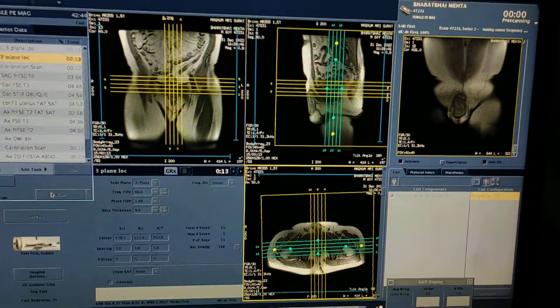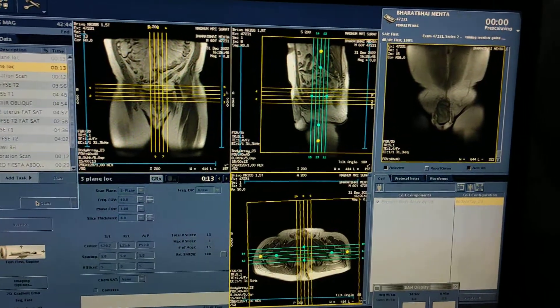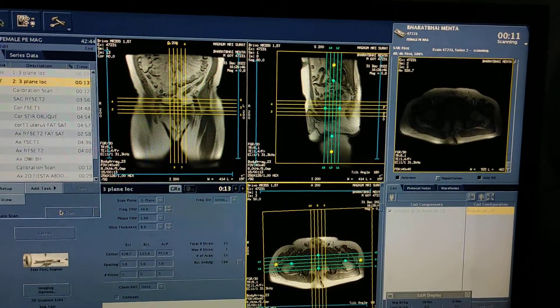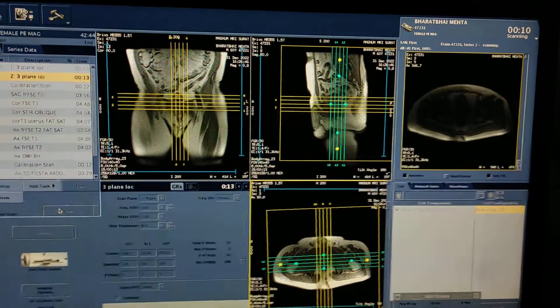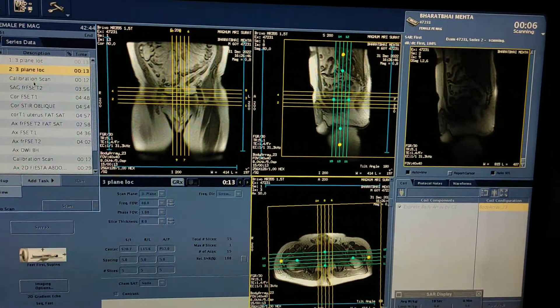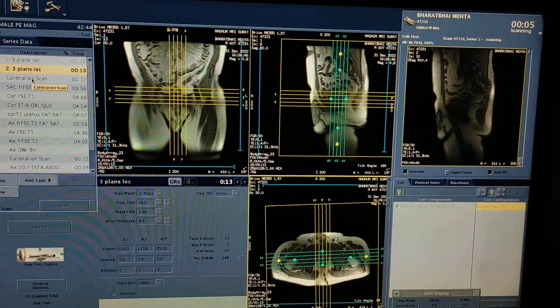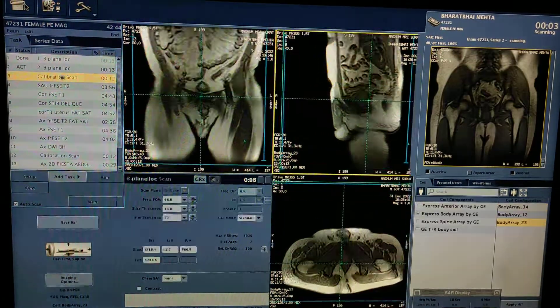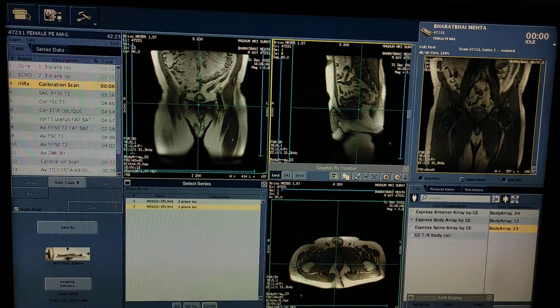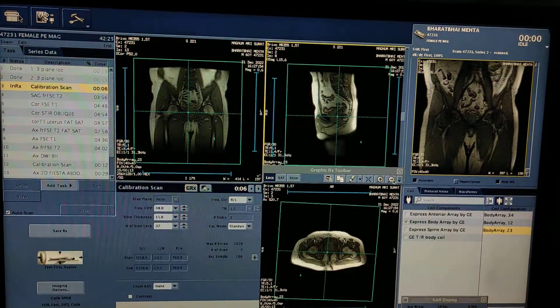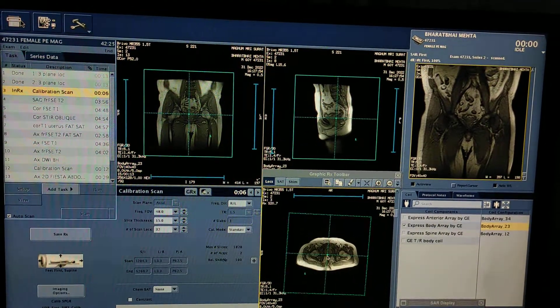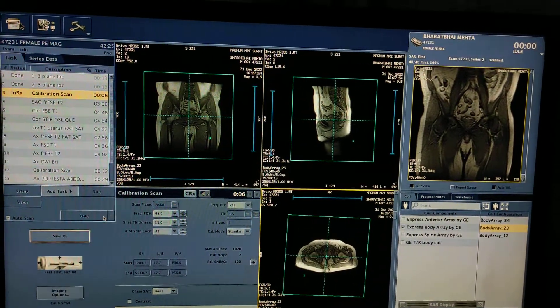Prostate MRI is similar to a female pelvis scan, so there is no need to worry. Click on calibration, select the second localizer. Now you have to calibrate the localizer scan.